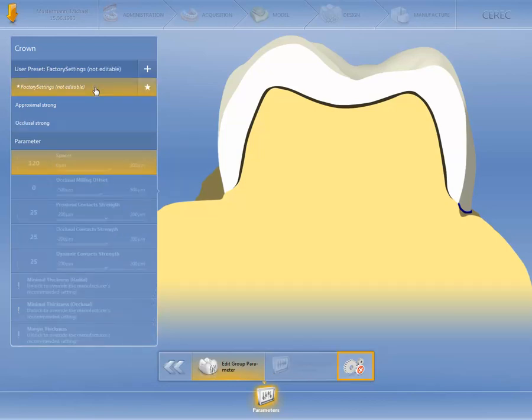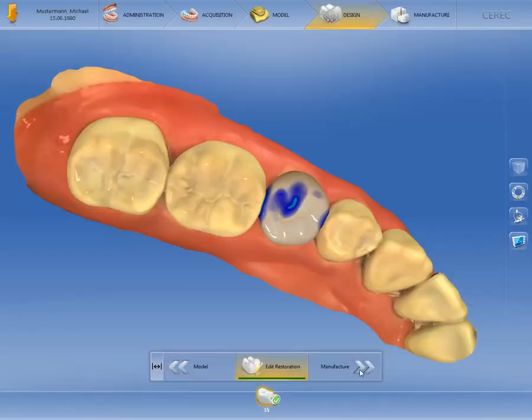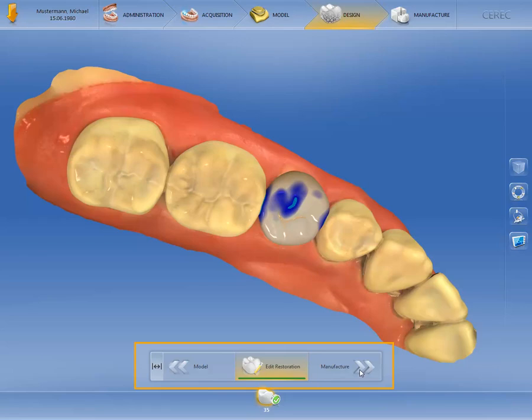Let's leave the Global Parameter Settings area to return to our single tooth restoration. The restoration has been calculated based on the factory settings. In the step menu of the CEREC Software 4.5, only the phases are initially shown — in this case, Model and Manufacture.